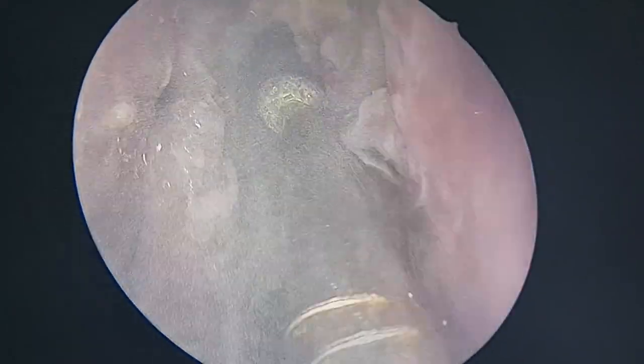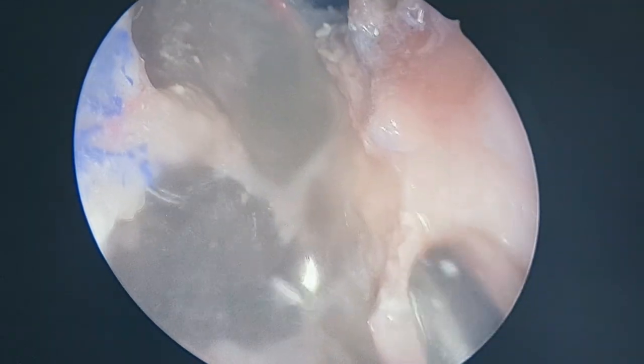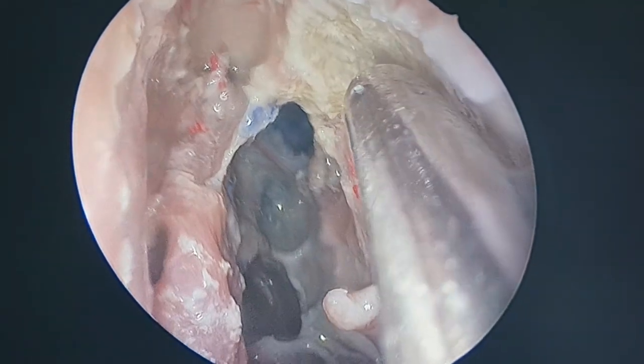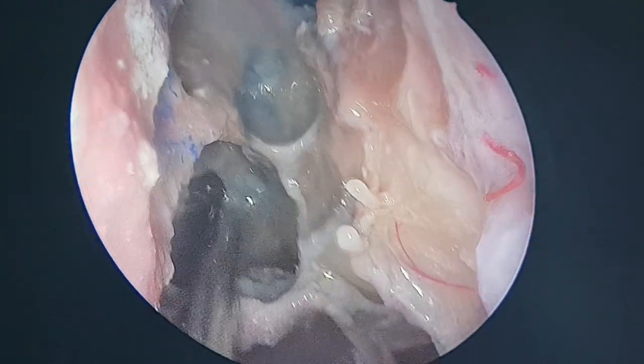No way to get into the orbit in this position. No, we are above the orbit. The orbit is, see, left inferiorly. See, this is your lamina. See, this is your lamina. And this is where I am drilling. Yes, that's a very important point he raised.